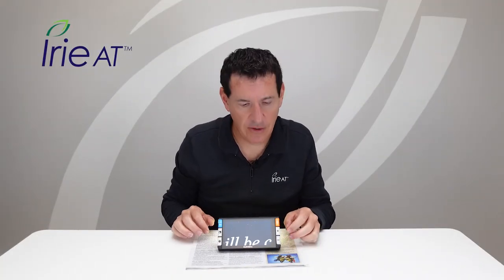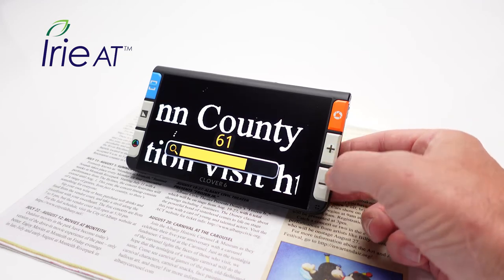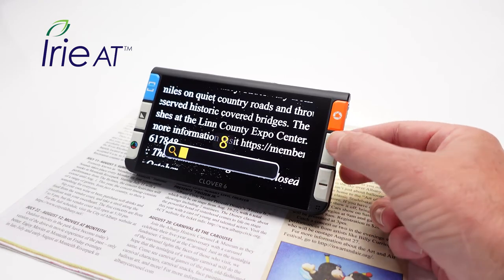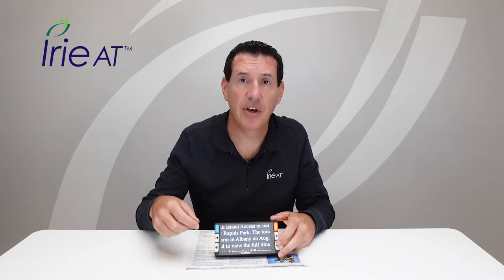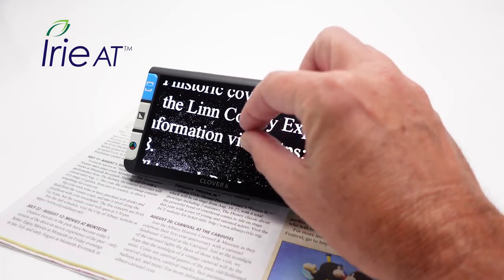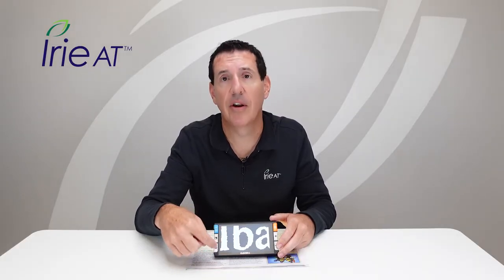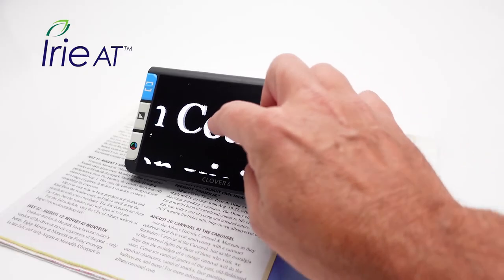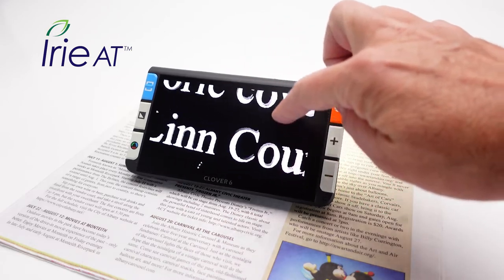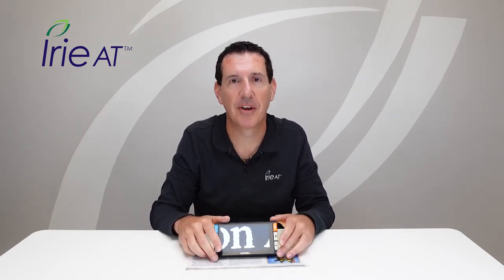If you want to zoom in and out, there are two ways. You've got two rectangular white buttons on the right side with a plus and a minus — the plus increases magnification and the minus decreases it. You also have a touch screen, so you can pinch and zoom: spread two fingers apart to increase the image or pinch them together to decrease it. In addition, if you want to read around without moving the device, you can just move your finger on the screen to do live panning — press on the screen and move up, down, or any direction. A really handy ergonomic feature.